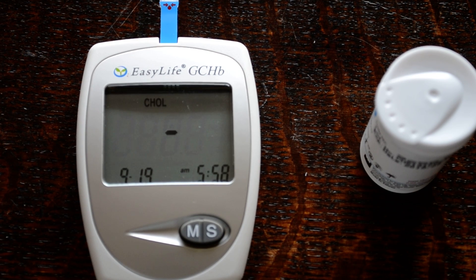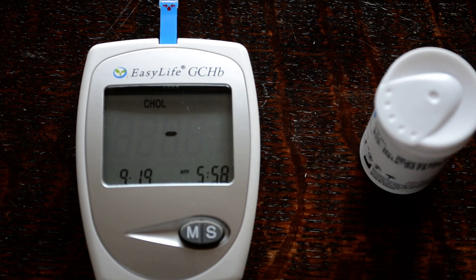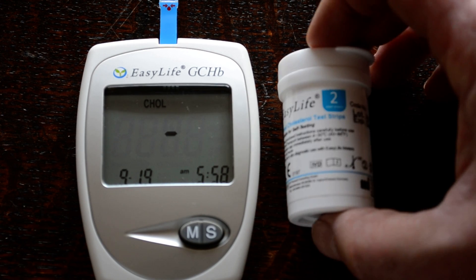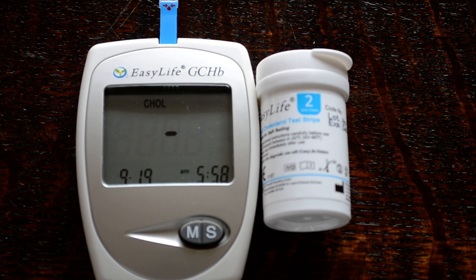The beauty of this meter system is that it's low cost — around £39 to £45 for the meter system, and around £16 to £17 for a pack of 10 cholesterol test strips. So it's not an expensive way to do a series of accurate cholesterol checks. Another great feature is the inboard memory, which retains previous readings — on the cholesterol side it will display up to 50 previous readings.